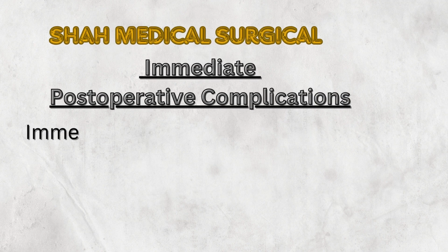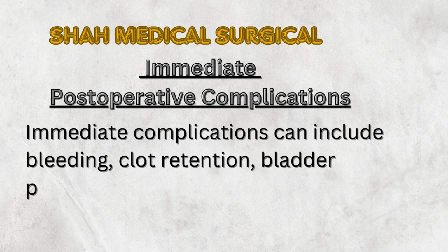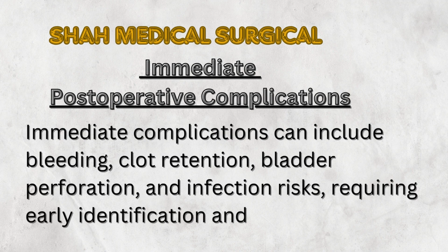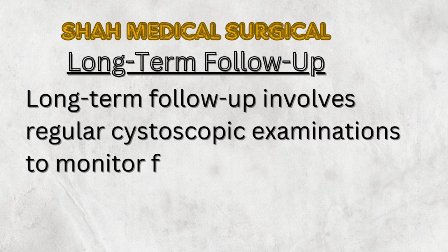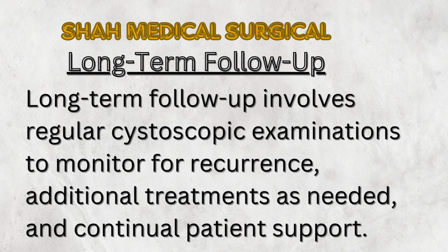Postoperative complications. Immediate complications can include bleeding, clot retention, bladder perforation, and infection risks, requiring early identification and management. Long-term follow-up involves regular cystoscopic examinations to monitor for recurrence, additional treatments as needed, and continual patient support.